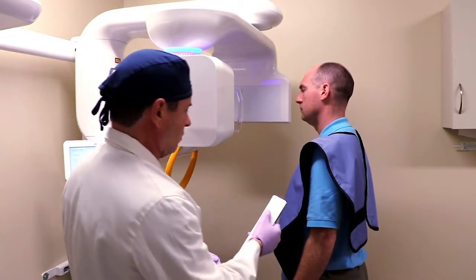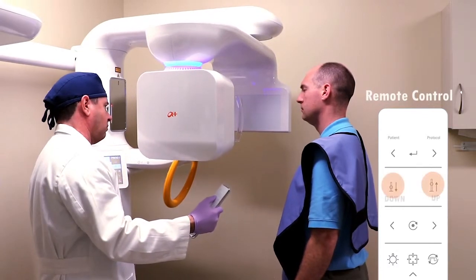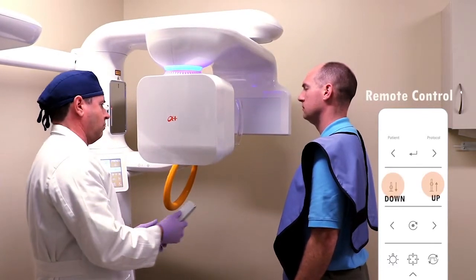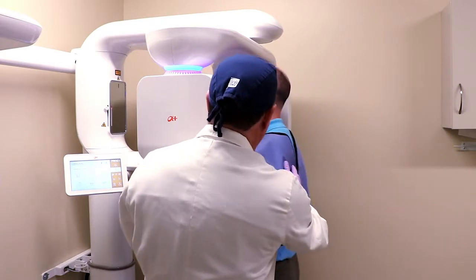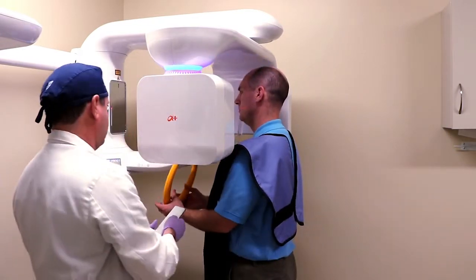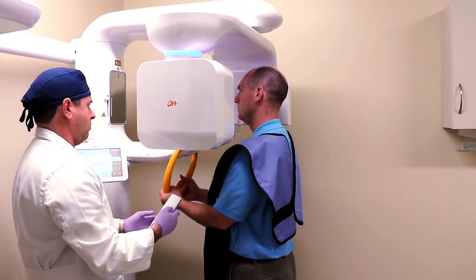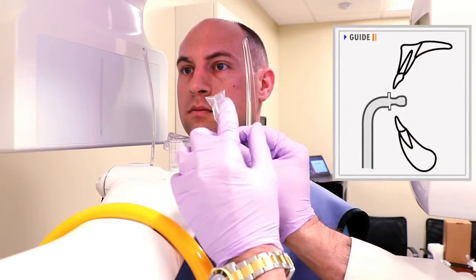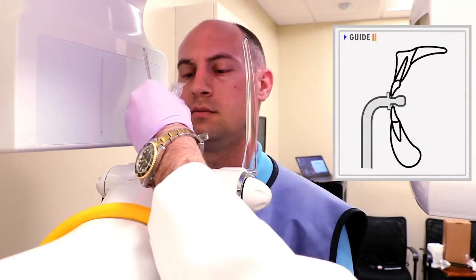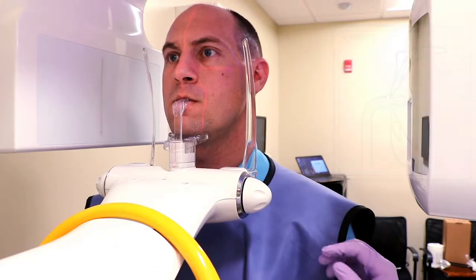Adjust the height using the remote control buttons and guide the patient to the rescan. Instruct the patient to grasp the yellow handle. Place a disposable hygienic cover over the bite stick, and inform the patient to bite their anterior teeth into the groove on the bite stick.